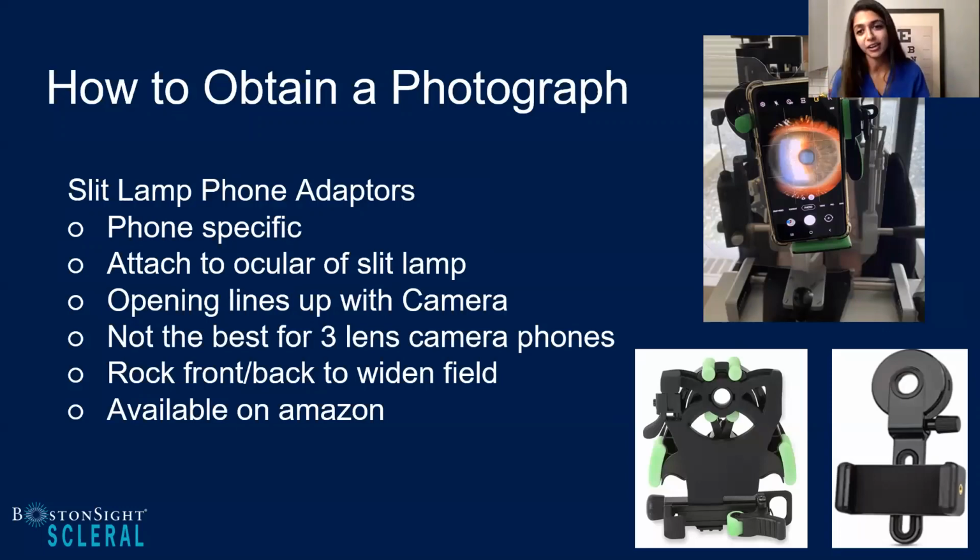So I highly recommend for those that can, especially in this day and age, we're all at the mercy of our cell phones and our smartphones, to really investigate an adapter. There's so many different adapters that are available on the market. They tend to be phone specific. So if you're not an Apple lover and you prefer your Androids, that's okay too. You'll find something that fits your device.